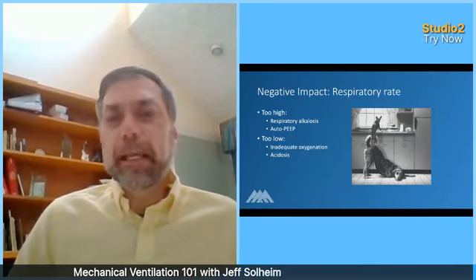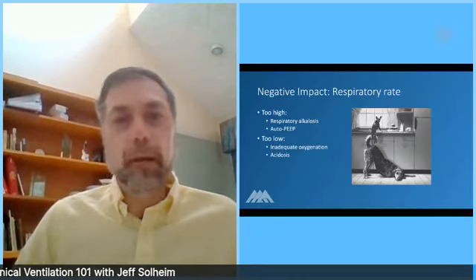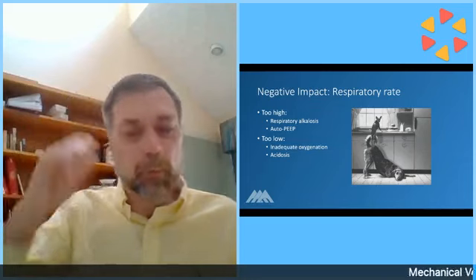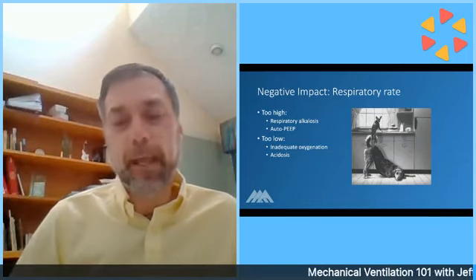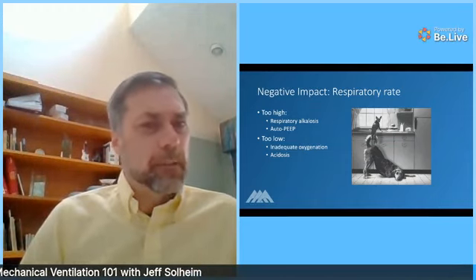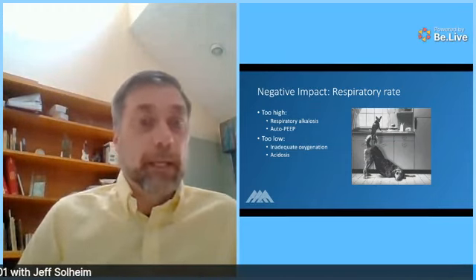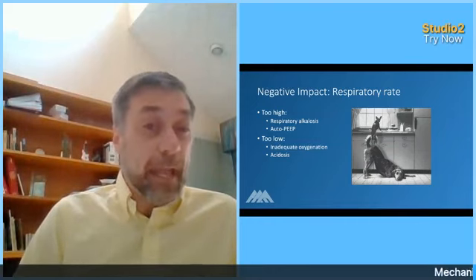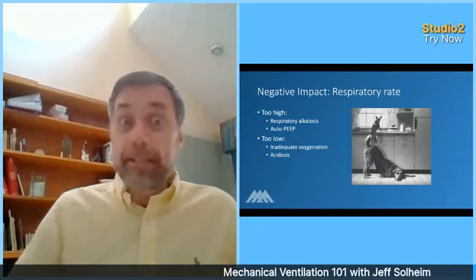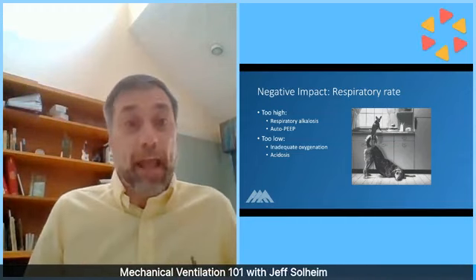So what is the negative impact of respiratory rate? Before I leave respiratory rate, I just want to talk about the one negative impact. There aren't a lot of negative impacts of respiratory rate. You can just turn it up with one caveat, and that is simply to remember your patient's paralyzed. Okay. If they're intubated, they're paralyzed. And paralyzed people can't actively exhale. They have to passively exhale. And it takes longer to passively exhale than actively.